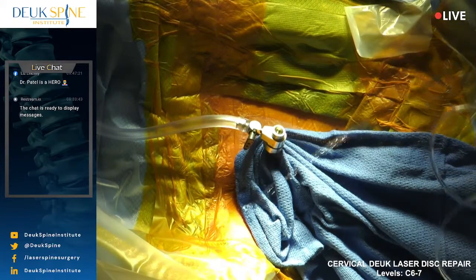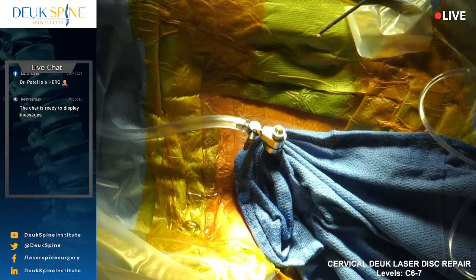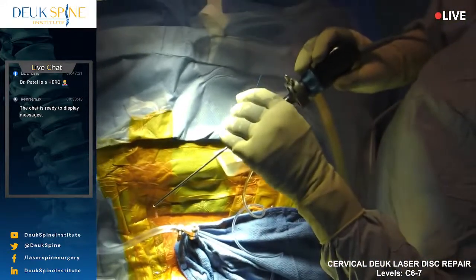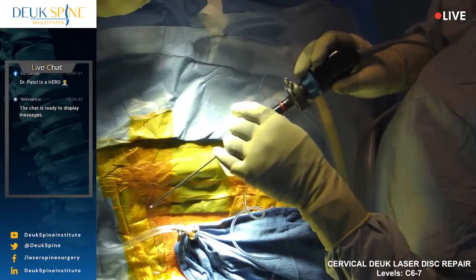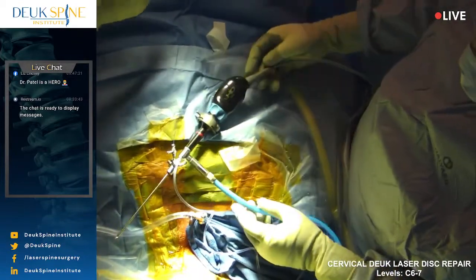Start the irrigation. All right. Let's show everybody this rig that we use. Can you see the rig, Diego? The endoscopic rig. Yes. You all see this? Yes, we see it.